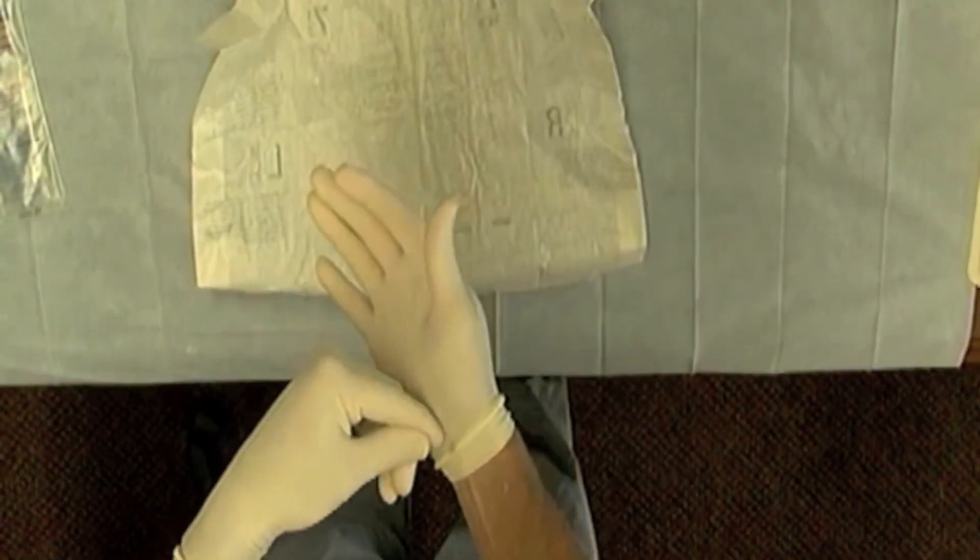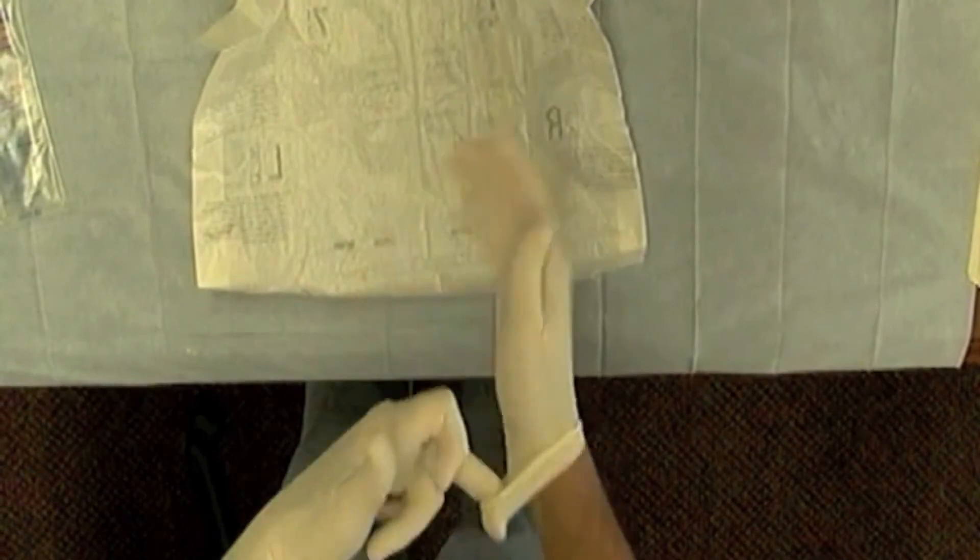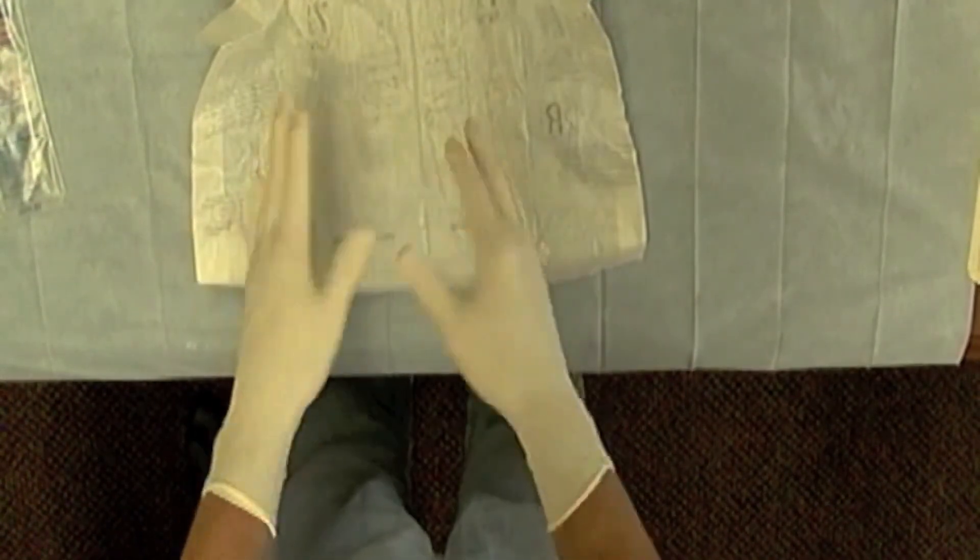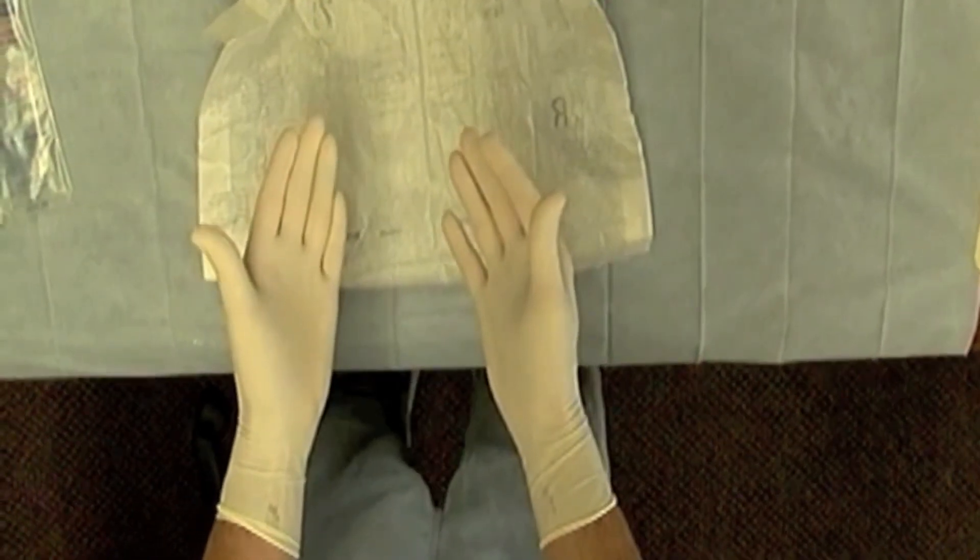Now I can come back and take this and come on the inside and adjust my gloves, and thus open gloving technique.